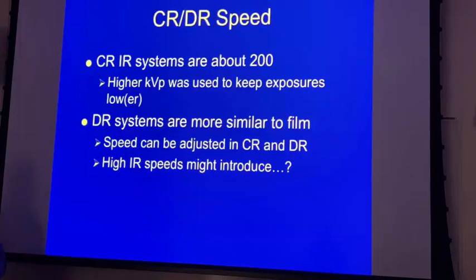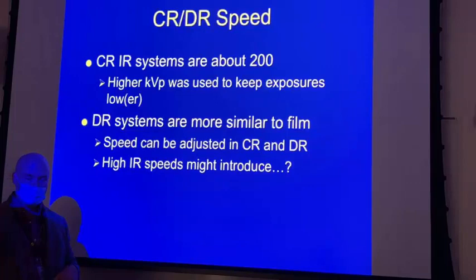Did the patient dose go up? Absolutely it did, because if you increase kVp and you don't reduce mAs, then your patient dose goes up, but does it double? And the answer is no, because you get more penetration through the patient.